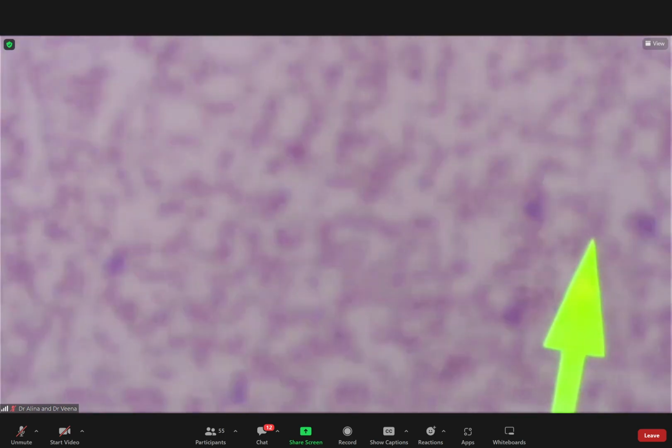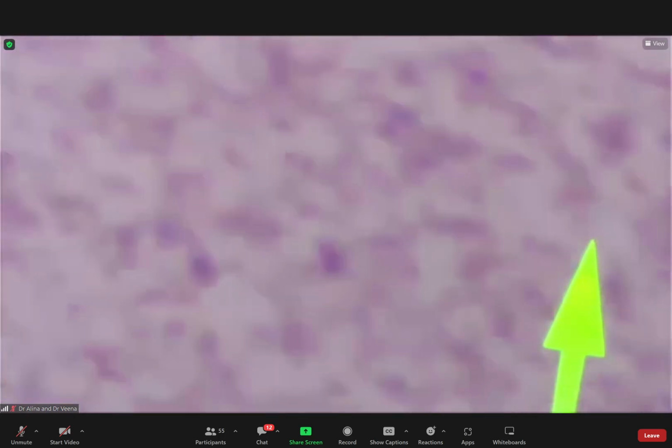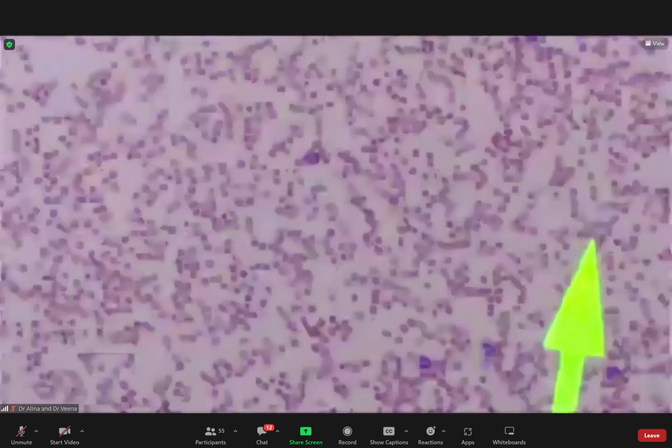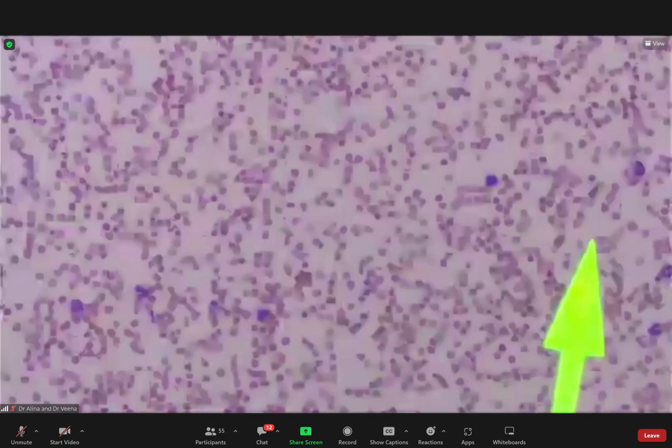The next case is a 32-year-old lady, G5 para 2+2 at 24 weeks, investigation for worsening anemia. Okay. So this is similar to the case that we saw earlier, right? You scroll and scroll and scroll, and you just cannot find a lot of cells with central pallor.